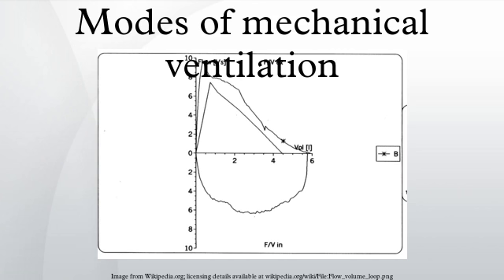If there is a change in the mechanical properties of the lung, thorax, and patient effort, the delivered tidal volume will be affected. The user must then regulate the pressure support level to obtain desired ventilation. Pressure support improves oxygenation, ventilation and decreases work of breathing. Also see adaptive support ventilation.